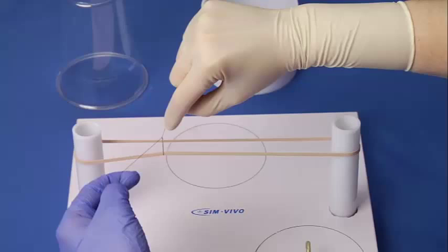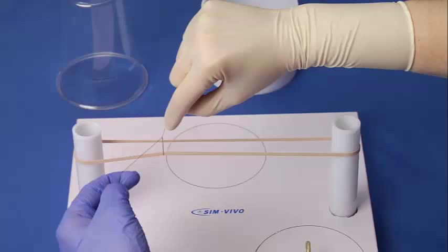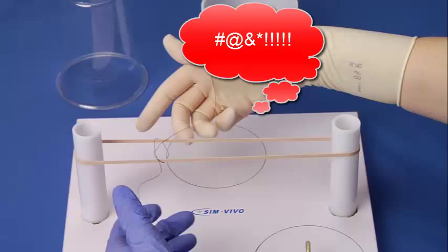you may cinch your first throw down on a structure only to find out that before you can place the second throw, the tissue has pushed the first throw open. There are two ways of dealing with this. The first is starting with a surgeon's knot and the second is using a slip knot.